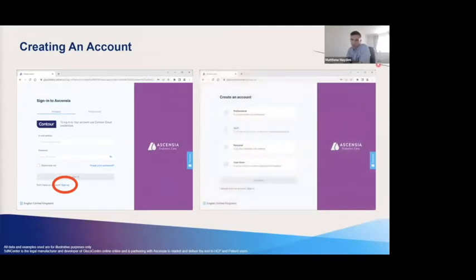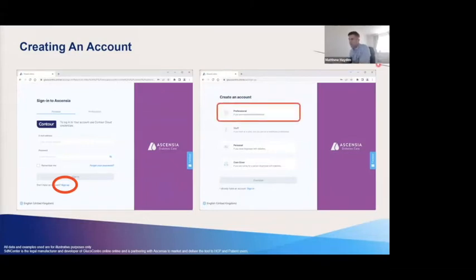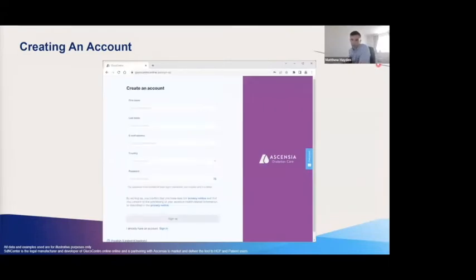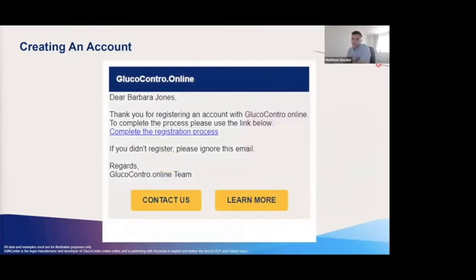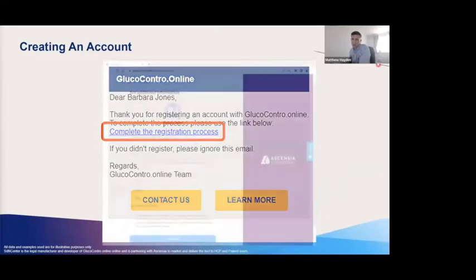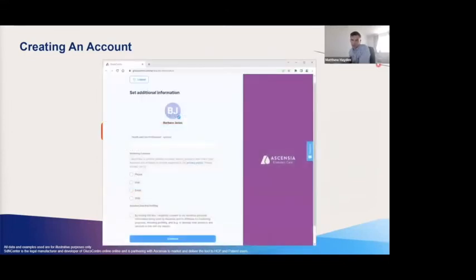There are four types of accounts available. The staff account is currently under development, but your patients would choose the personal account, and there is also the option of a caregiver account. For yourselves as healthcare professionals you would select the professional account and click continue. You then complete the required details, check the box to agree to the terms of service, and click sign up. You will then receive an email to verify your identity by clicking the link provided. Once you complete some additional details and your marketing consent preferences, your account is set up and complete.